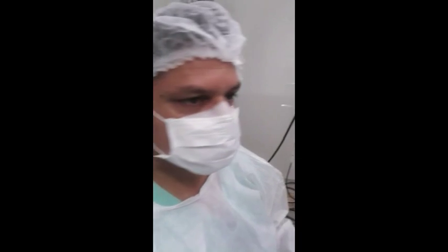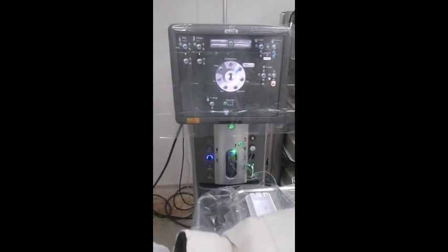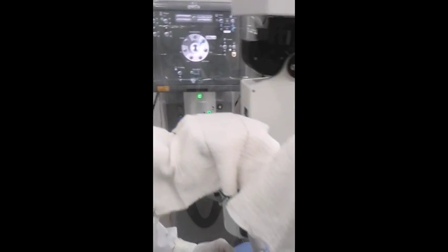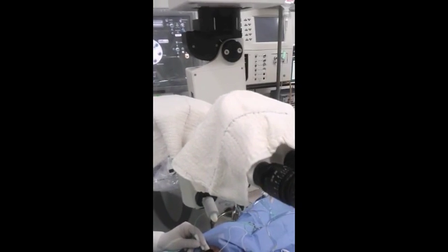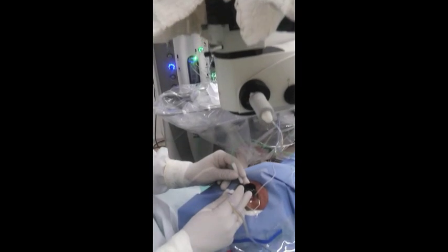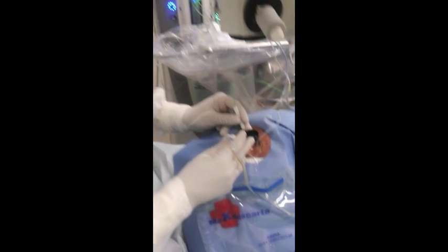We're going to use the Stellaris to do the vitrectomy. It's not a very easy case, it's actually a very tough case. I'm going to start now with the vitrectomy and soon thereafter do the 360 retinotomy.